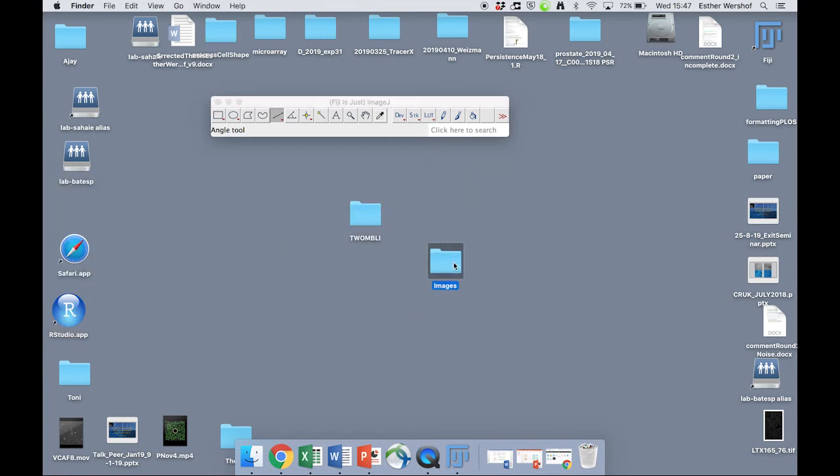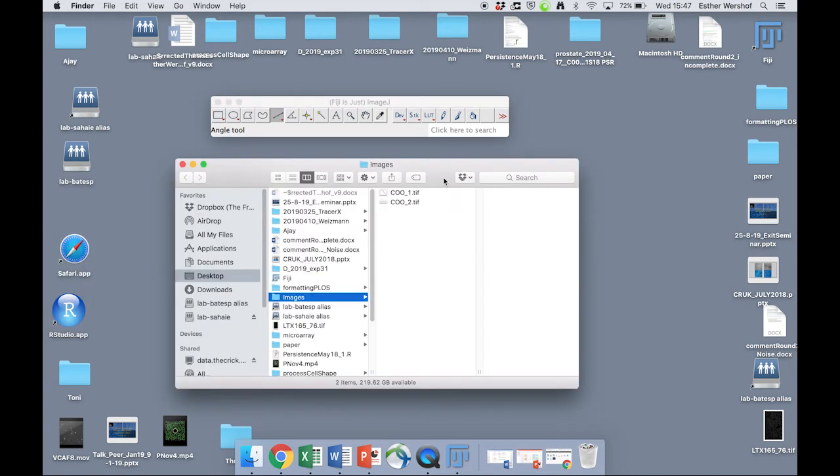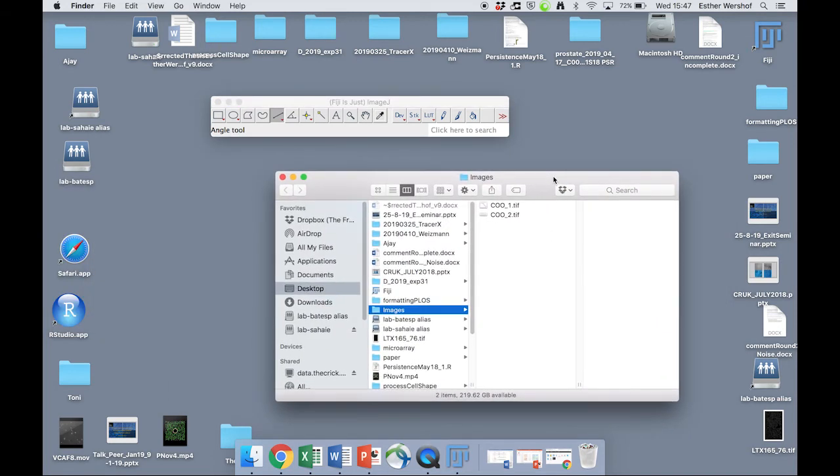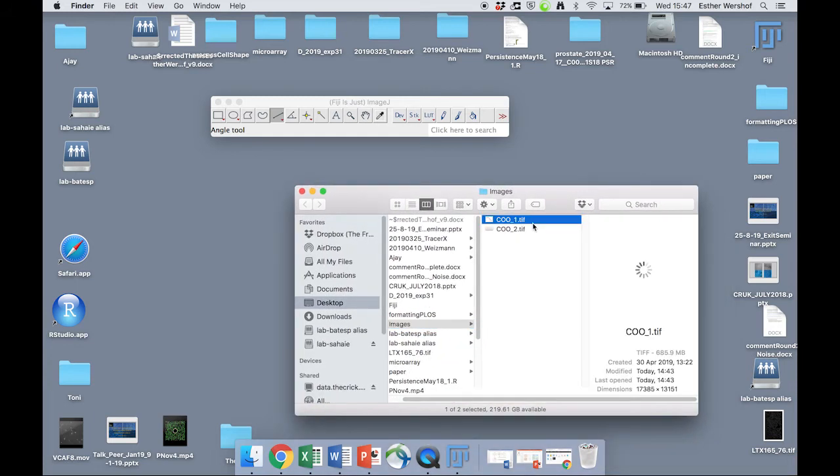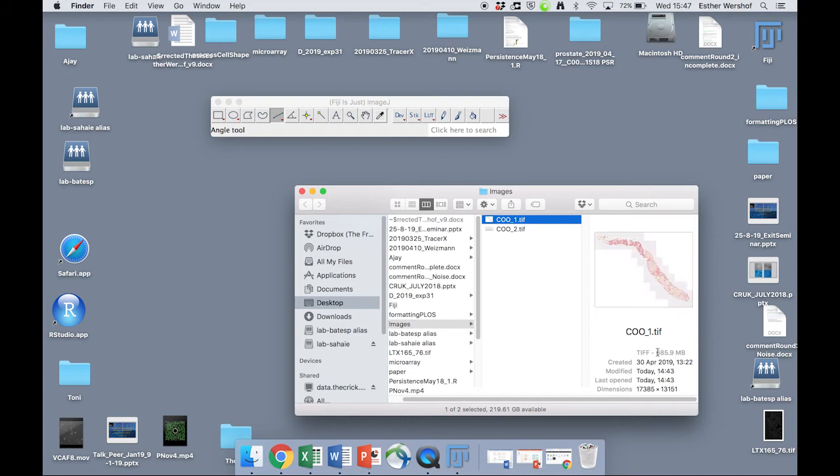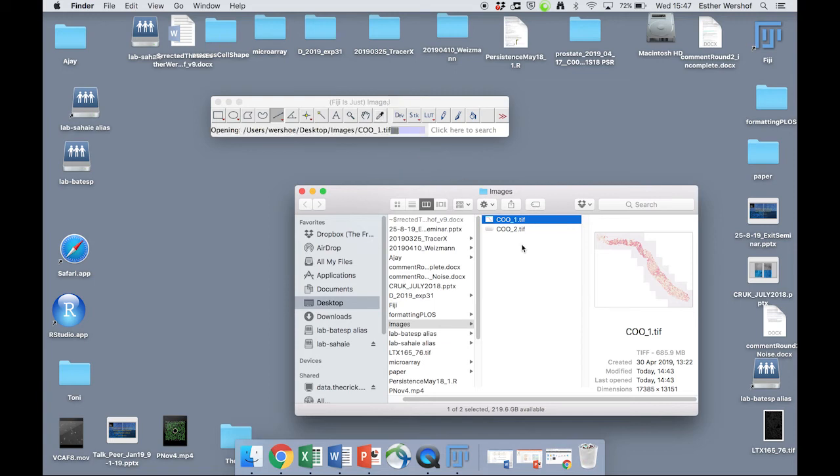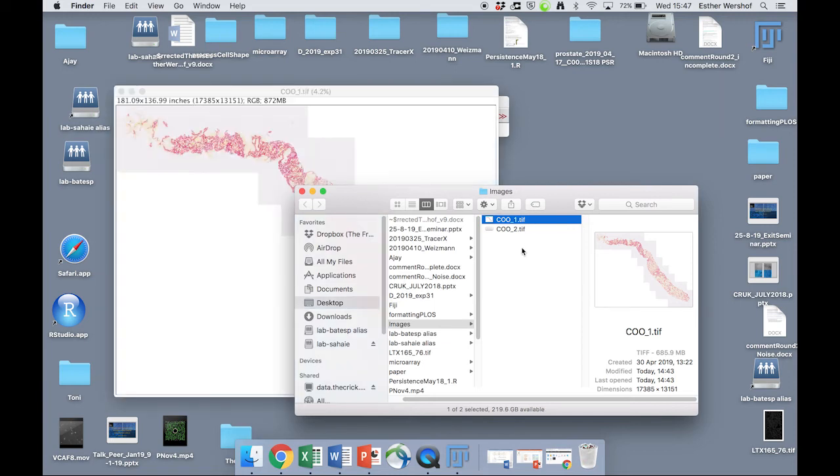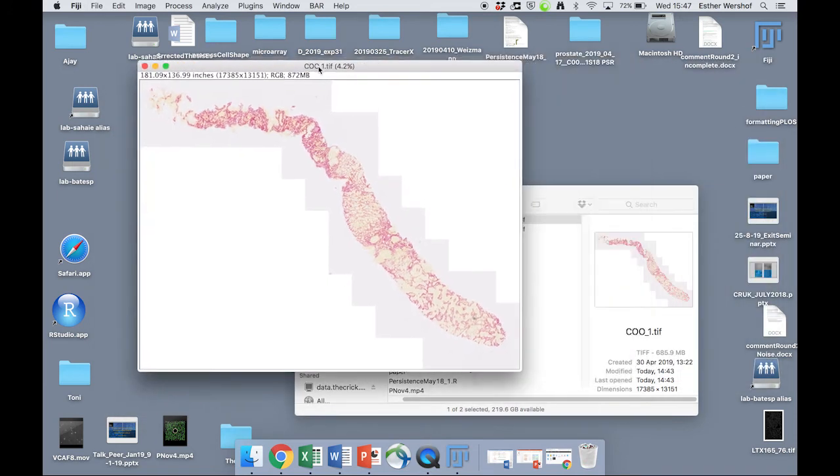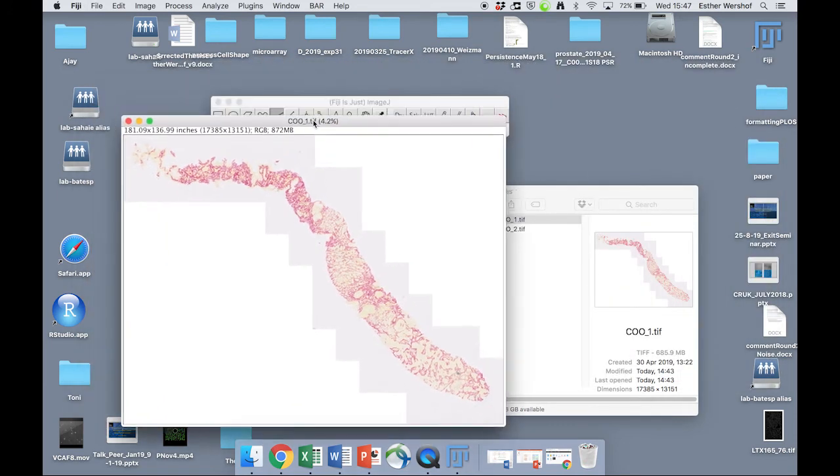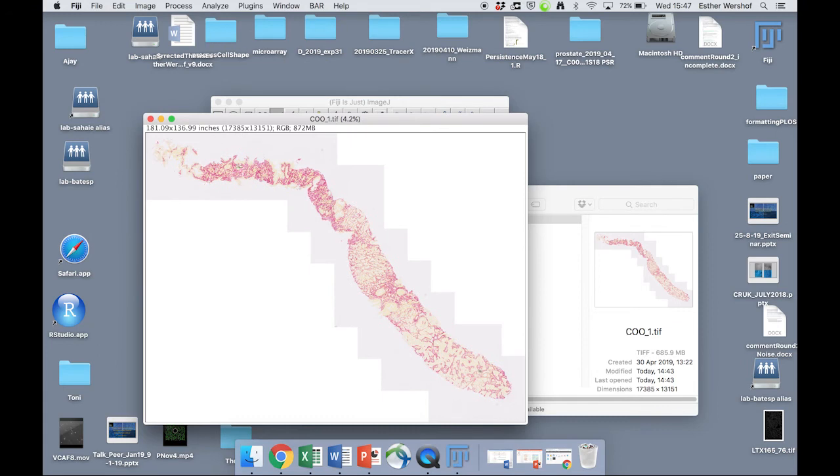Now, just got two example images here. And you can see that these are really large files. And generally, Fiji is going to struggle with something like this. But if we just open it up here, we see we've got a very large file. In addition to that, this is an image of a prostate and some areas of this are cancerous and some of them are not.